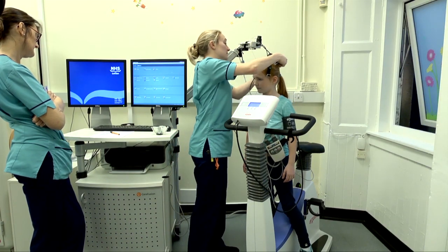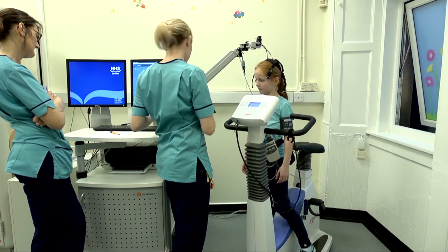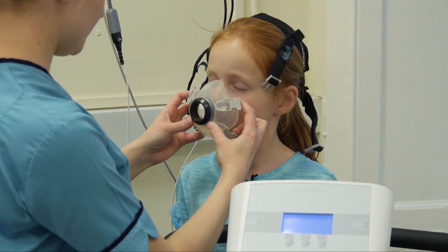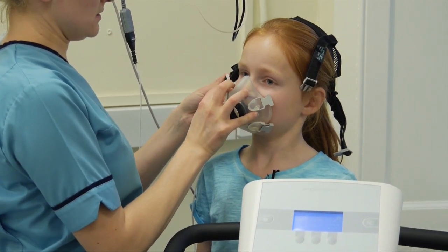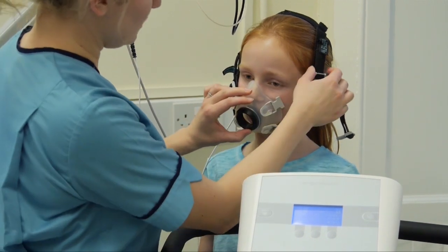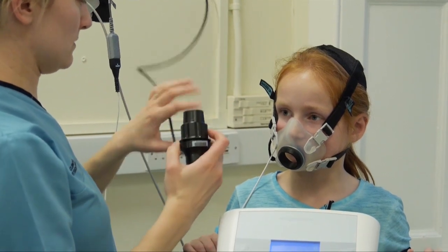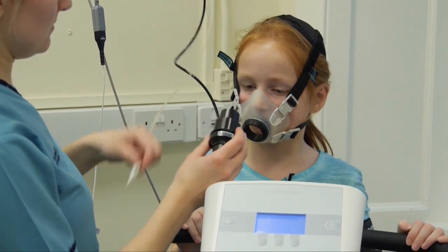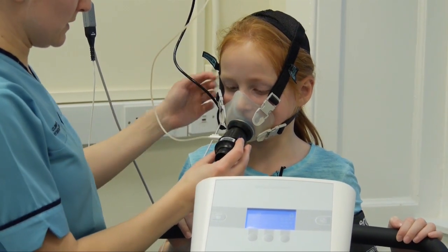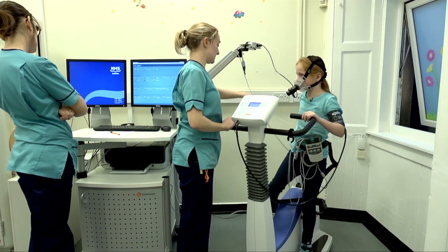So this is going to sit on over the top. Just going to pop this on over your nose. And to hold that mask on, we're going to use this head strap here. This mouthpiece here will sit into the front of the mask like that. Now, can I get you to slide yourself up onto that seat?